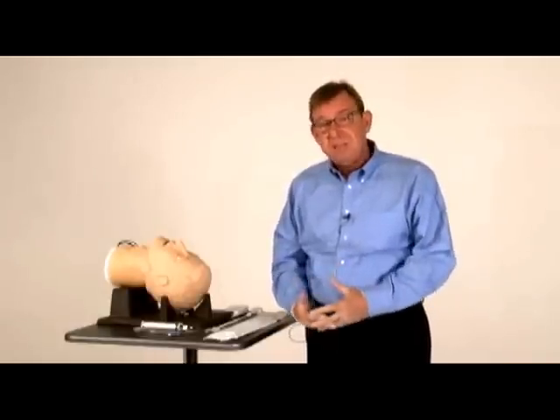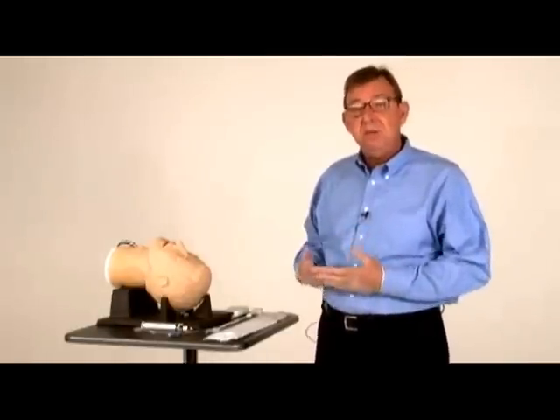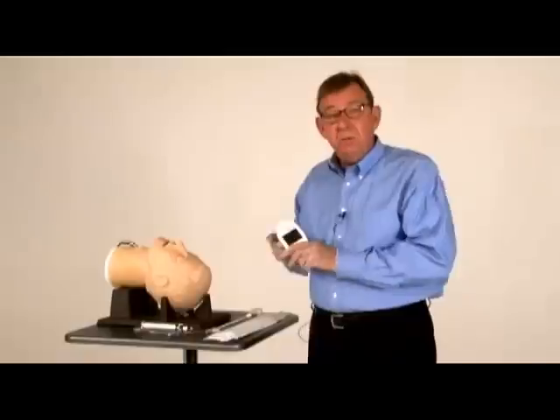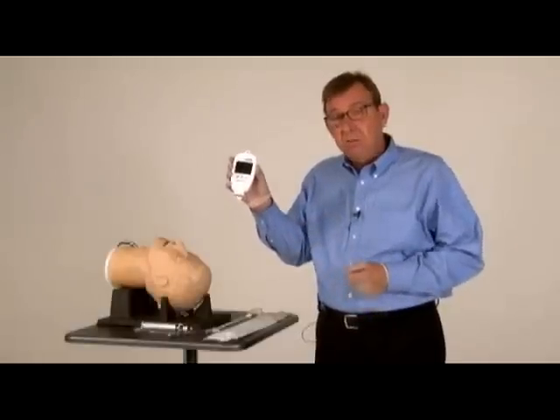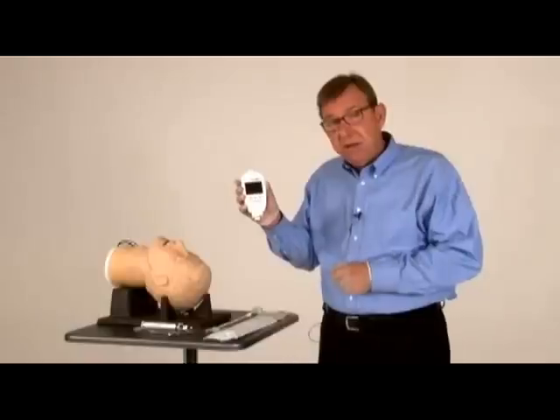The ViewStick is a fast and remarkably easy-to-use video laryngoscopy device that allows the clinician to actually see what the end of the ET tube would see. It consists of two pieces. One is a very lightweight and rugged 4-ounce video handpiece. This incorporates a 320 by 240 resolution color display and three different buttons that I'll explain in a second.